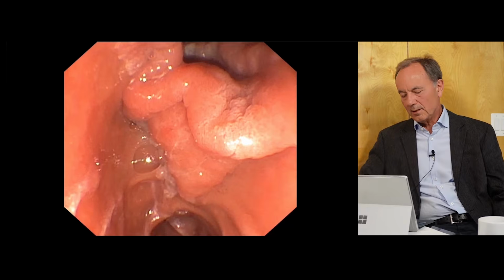And as you know, the Australian group recently published a trial comparing a historical cohort with a prospective cohort, comparing this hybrid technique, so hot resection of the papilla plus cold resection of the lateral part, with a conventional hot resection of the whole neoplastic lesion, and there was no significant difference in terms of bleeding, although the study was not powered for that.